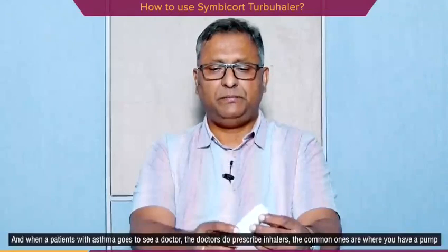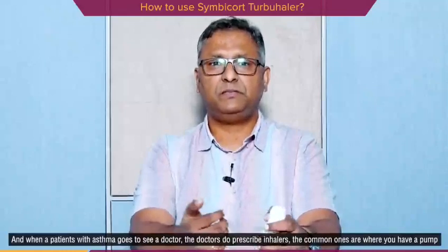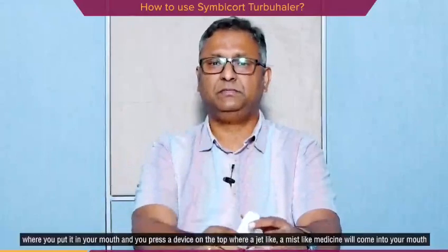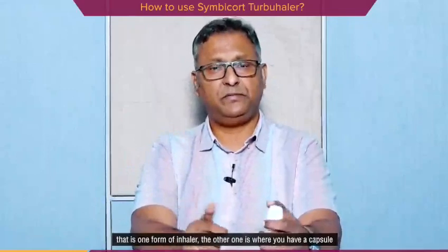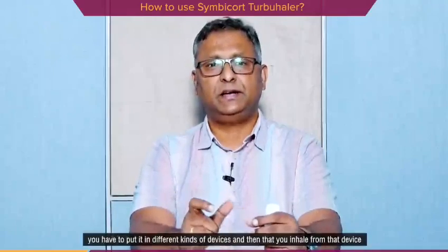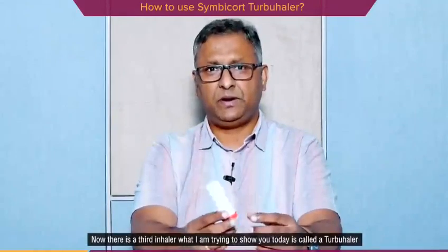When patients with asthma go to see a doctor, the doctors do prescribe inhalers. The common ones are where you have a pump which you put in your mouth and press a device on the top, and a mist-like medicine comes into your mouth. That is one form of inhaler. The other one is where you have a capsule. You have to put it in different kinds of devices, and then you inhale from that device. Now there is a third inhaler that I'm trying to show you today.